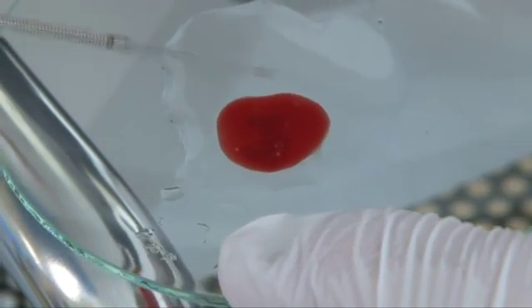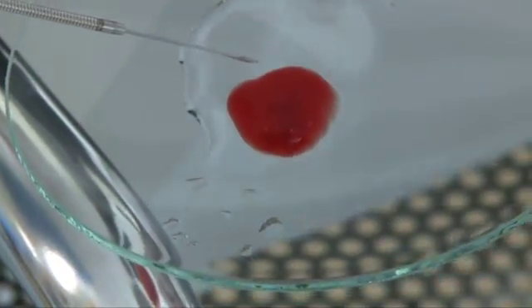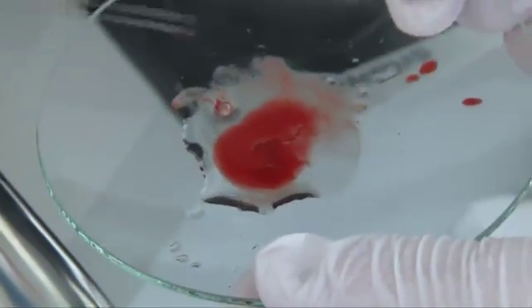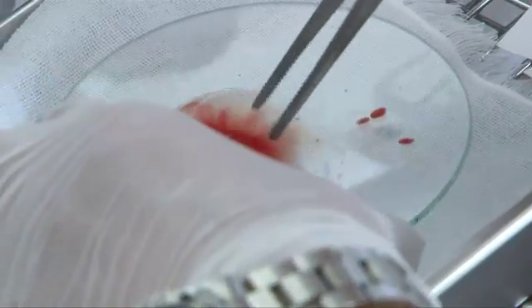So now this will go into cytolite, or will you make some slides to look at? Yes, there is a pathologist. So we will make slides, but also put some for cell block, I think, as well. And on the second pass, will you use the stylet again or no stylet? Usually I use the stylet again. Okay.